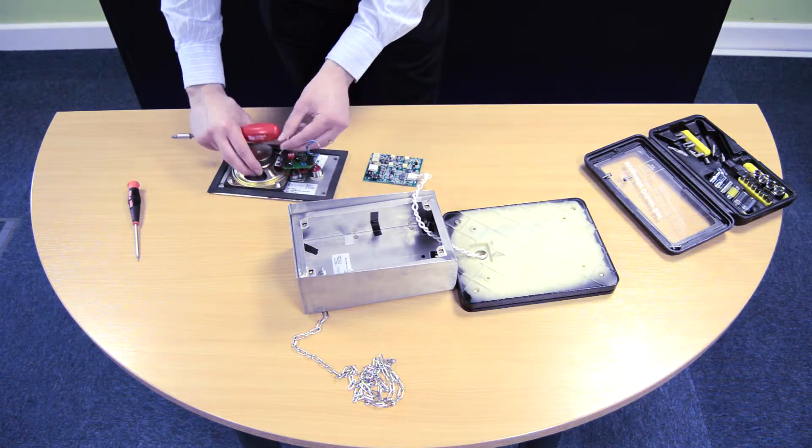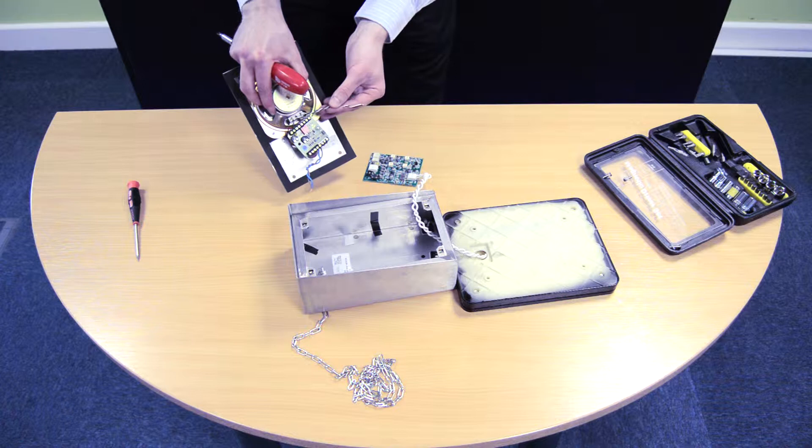Next I'm going to wire in the input signal, which is coming straight off the back contacts of this speaker.